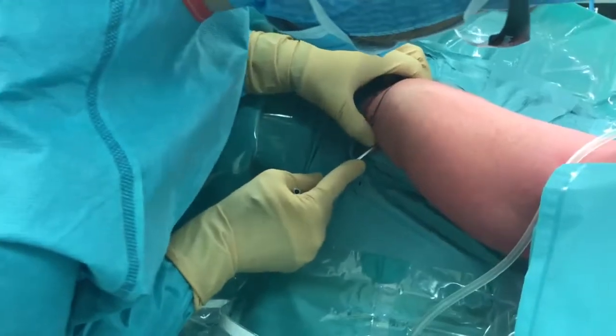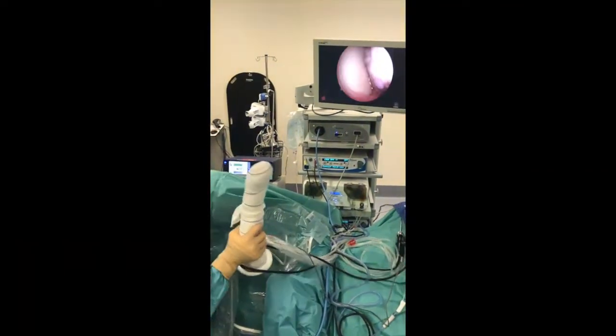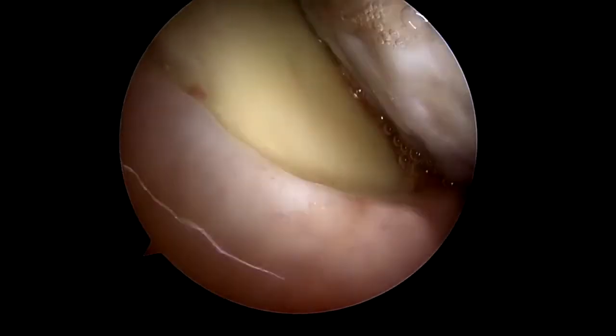In the beach chair position, the arthroscopy is commenced using a 70 degree arthroscope in the posterior portal. We confirm the presence of anterior shoulder instability with arm manipulation in abduction and external rotation.